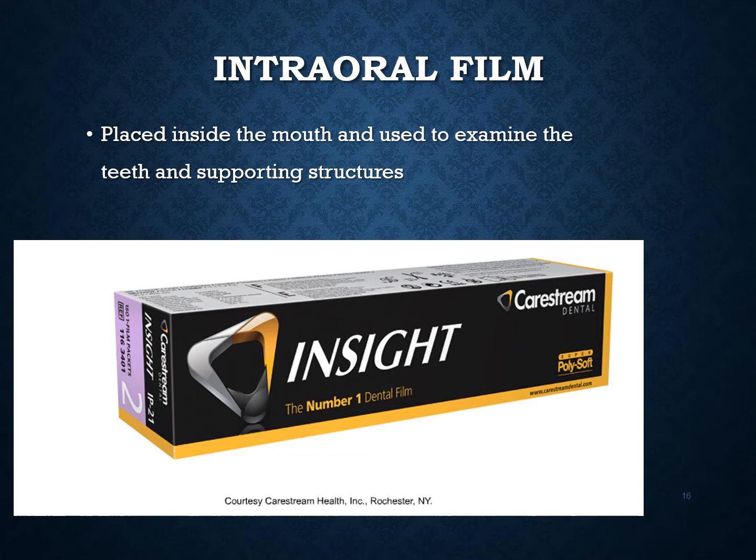The terms film and film packet are often used interchangeably and incorrectly. The film is the part with the emulsion and the base and the adhesive layer, all of that is what makes up the film. The film is inside the packet. However, a lot of times, if I say film, I mean the whole thing. If I say film packet, I'm talking about when I've separated them all.